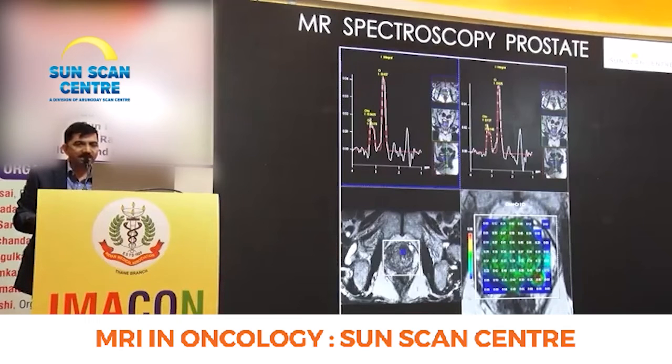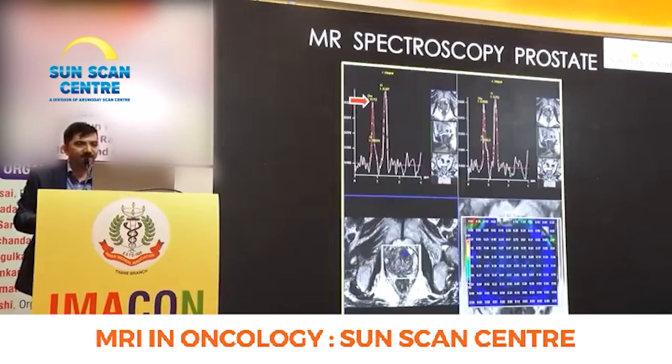So this is an example of a normal prostate, and this is an example of an abnormal prostate or a CA prostate where the choline level is extremely high. And mind you, this is a completely plain technique. Without contrast, you can have this accurate diagnosis.